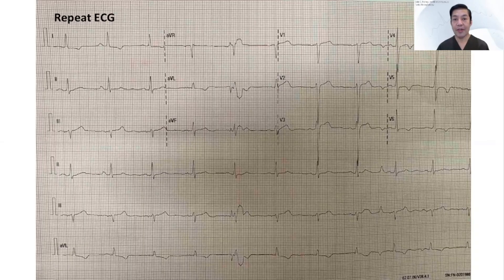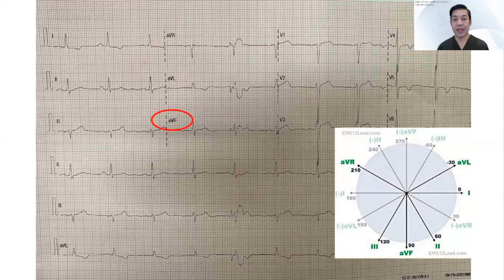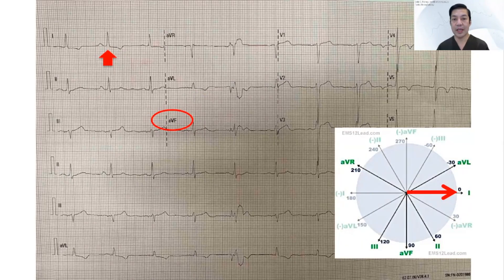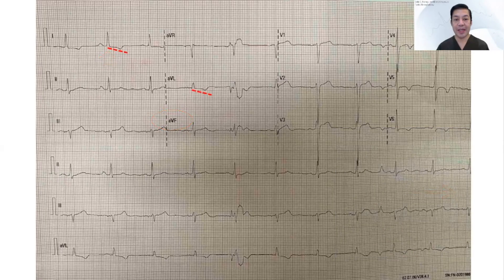So we have requested a repeat ECG, making sure that the electrodes are placed where they should be positioned, that the standard paper speed is at 25 millimeters per second, and the amplitude is at 10 millimeters per millivolt. Looking at the axis again using the same system, AVF still demonstrates equiphasic QRS, so the lead perpendicular to it is lead 1. Examining lead 1, which is now predominantly positive, it means the axis is going towards lead 1, which is zero degrees. Re-examining this ECG, we also note the presence of ST segment depression in leads 1 and AVL, and T-wave inversions in V4, V5, and V6.